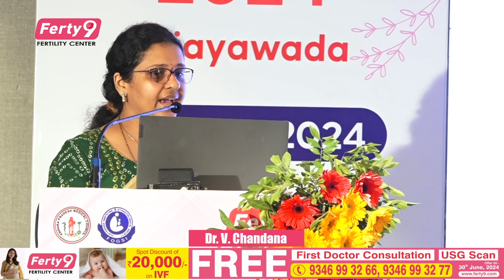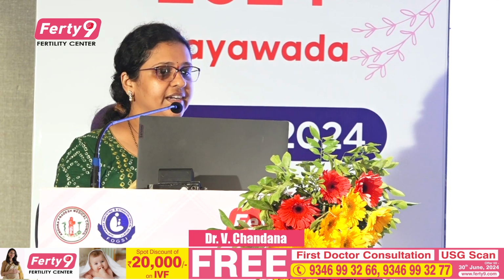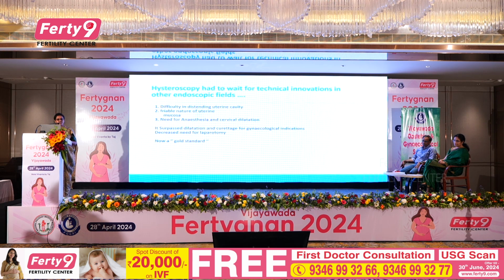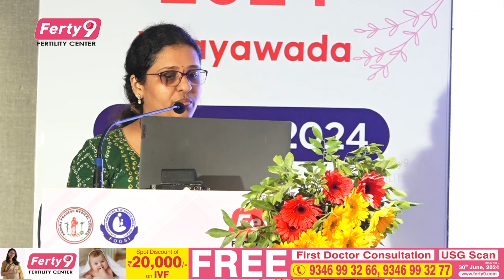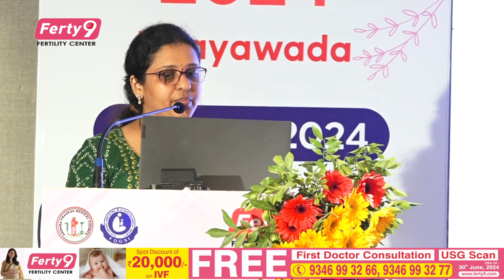Hysteroscopy had to wait for technical innovations in endoscopic fields. Difficulty in distending the uterine cavity, the friable nature of the uterine mucosa, the deadly bleeding that can happen, and the need for anesthesia and cervical dilatation were its hindrances in the initial days. It has soon surpassed dilatation and curettage for gynecological indications and also decreased the need for laparotomy for treating septate uterus and different uterine anomalies. And now it has set itself as the gold standard for endoscopic surgeries.